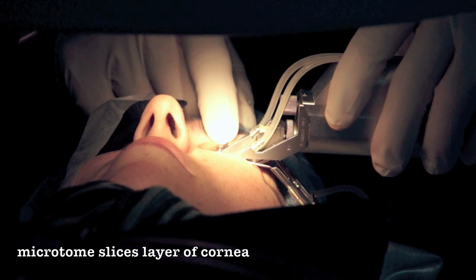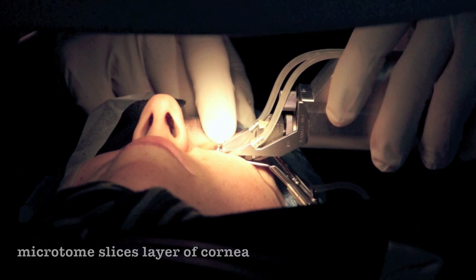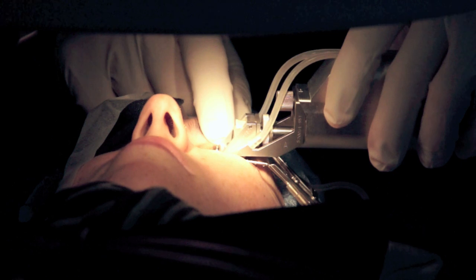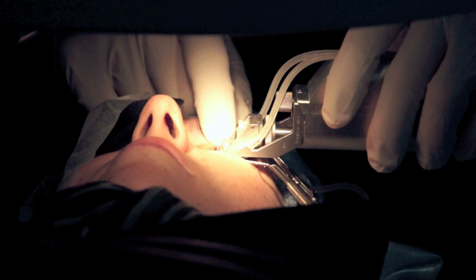Good. Did the orange light go out? Good. Hold steady. Perfect. You're doing great. Very nice. Good job. Next one. Very good. Hang in there.